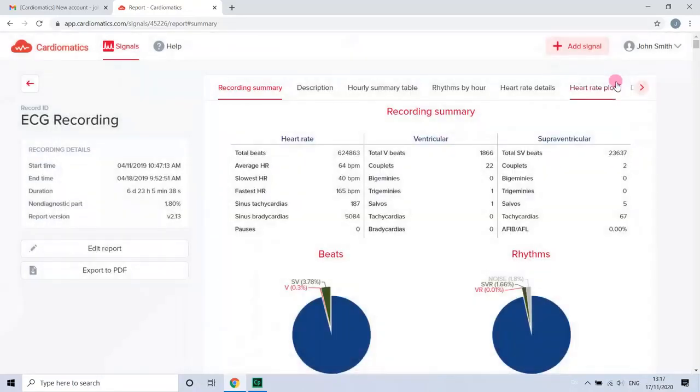Now you can enjoy an automatic easy-to-read report and base your diagnosis on it.